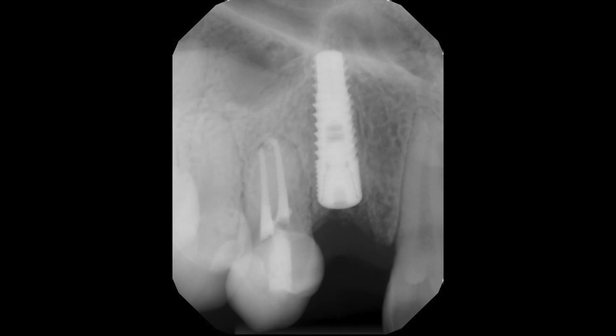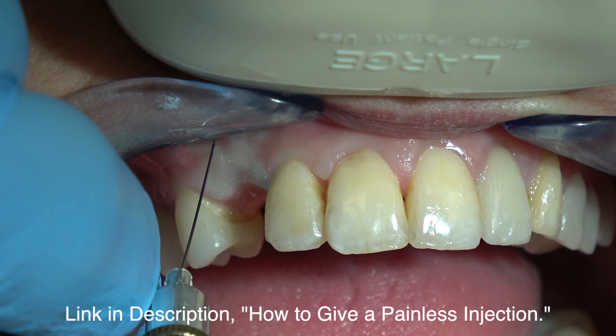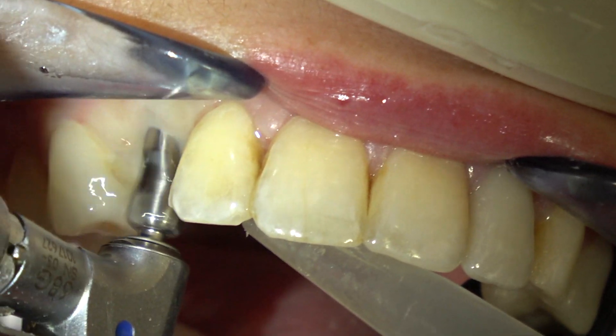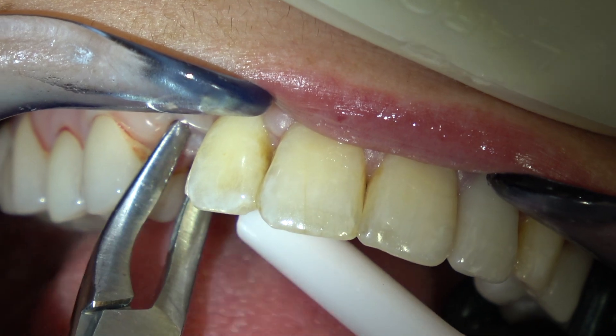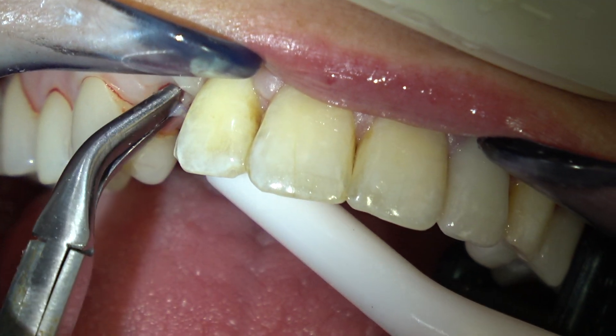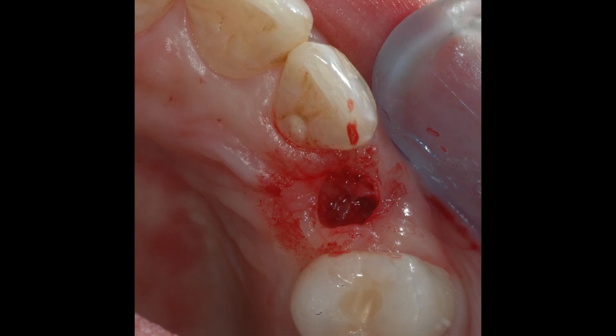The implant has osseointegrated for three months. After three months of healing, we give an injection and uncover the implant with a punch drill. These are just small rongeurs removing that core of tissue.